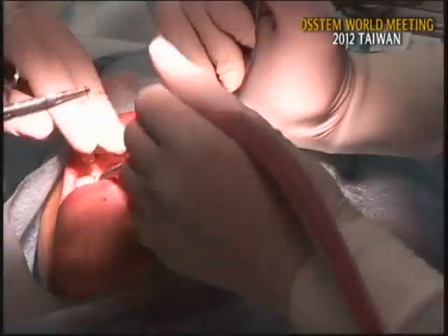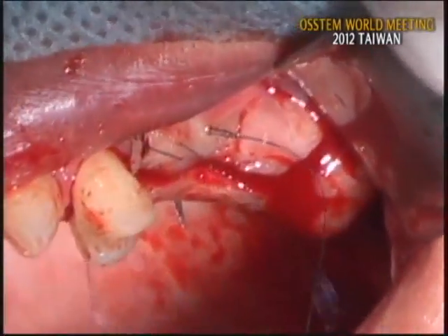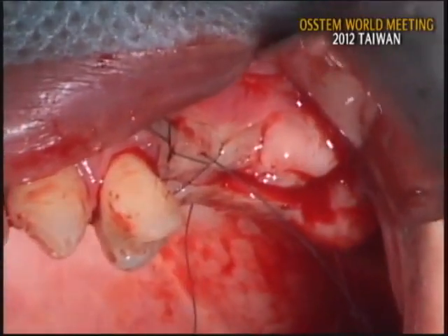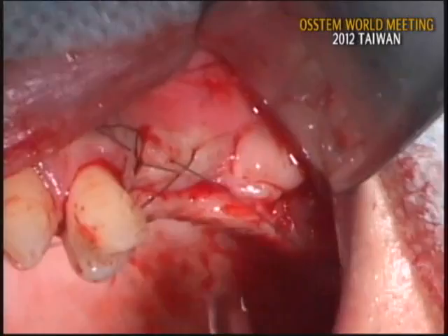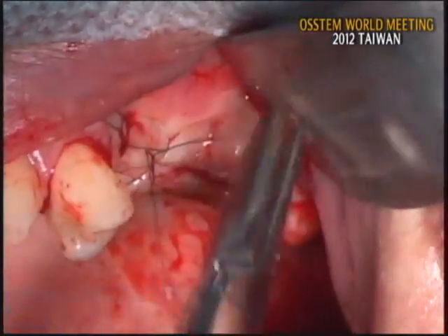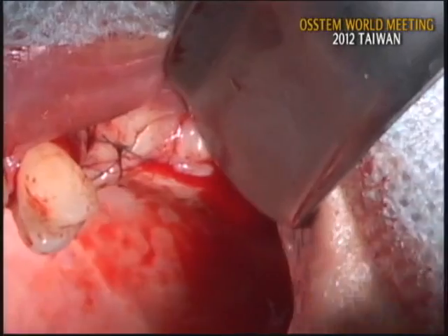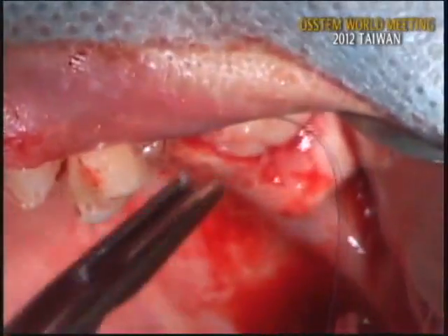Okay, I'll use the figure of 8 sutures in this site. Okay. This one. I'll continue the figure of 8 sutures.